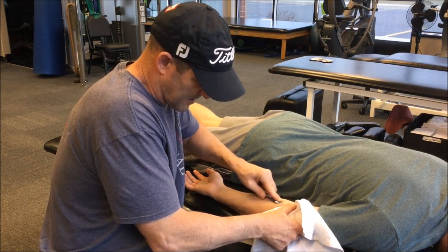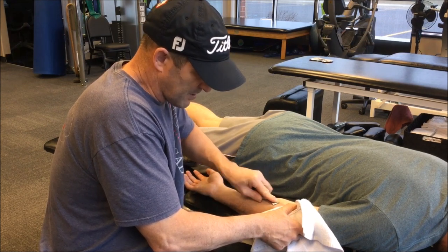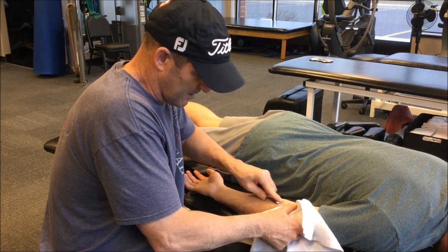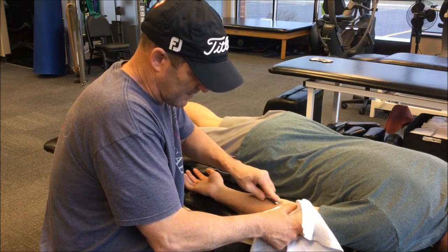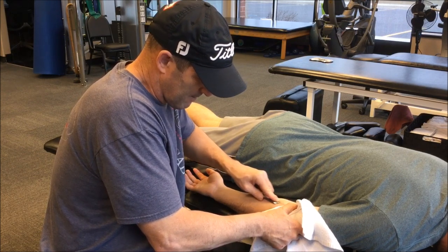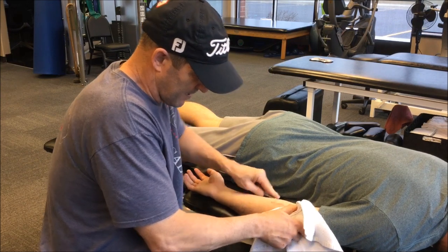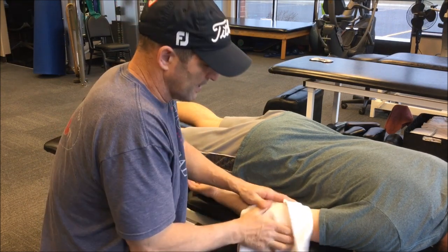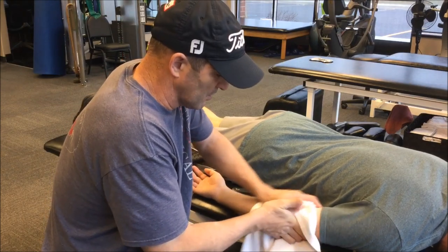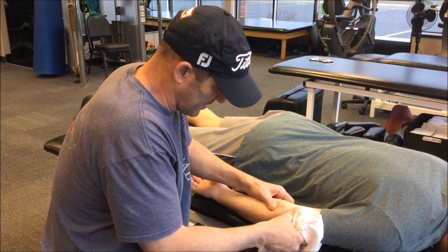I'll go more towards the inside — you can really feel it right there. Fibrous tissue has a very interesting feel, and with the Graston tools you can feel it — it's like going over bumpy rope. From there, I'll just let it calm down a little bit. You don't want to be banging on it for too long because it is somewhat uncomfortable, but it's so effective. Now you look at it — it's moving way better.